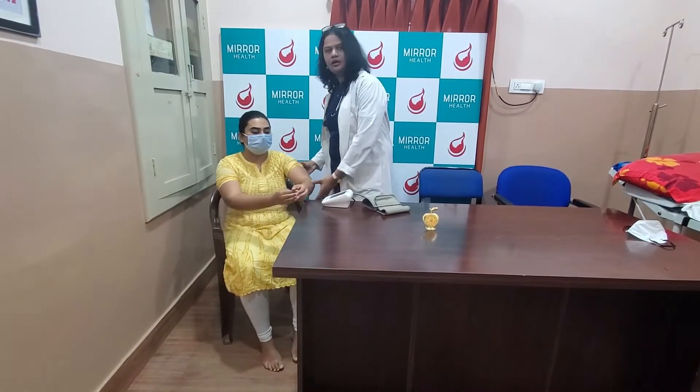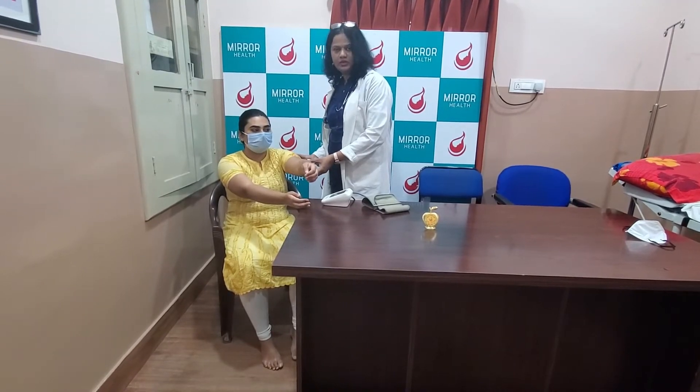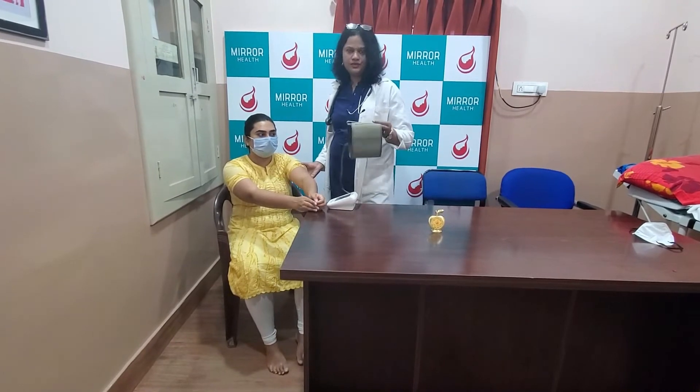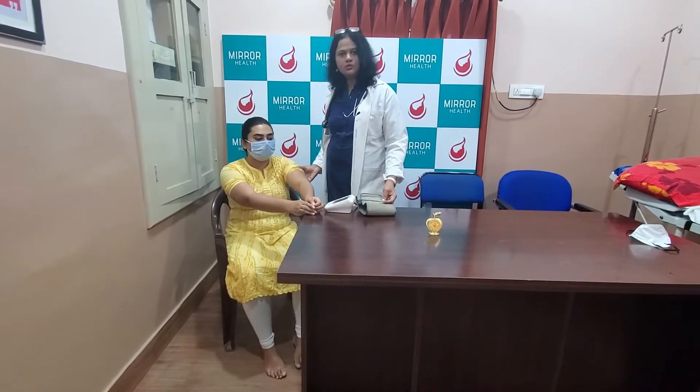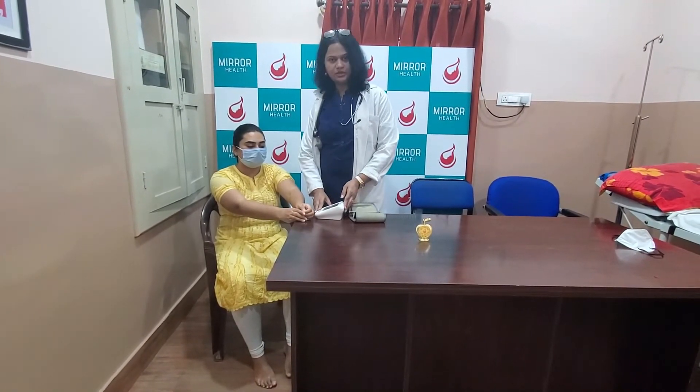Now I want to make sure that I assess the size of her arm and I feel it's of the regular size. I have made sure that it is less than 33cm, so a regular cuff should fit her easily. I am also going to make sure that her arm is at the level of the heart, and so is the machine. That is how I am going to place the whole thing.